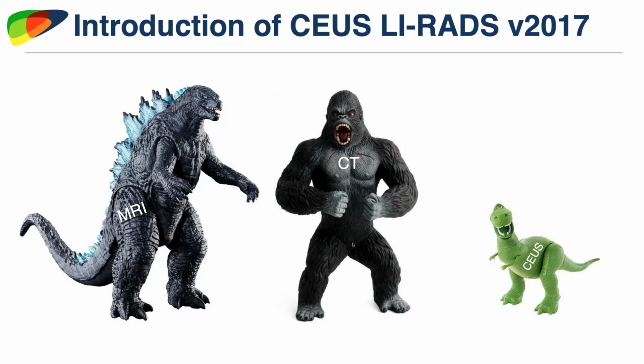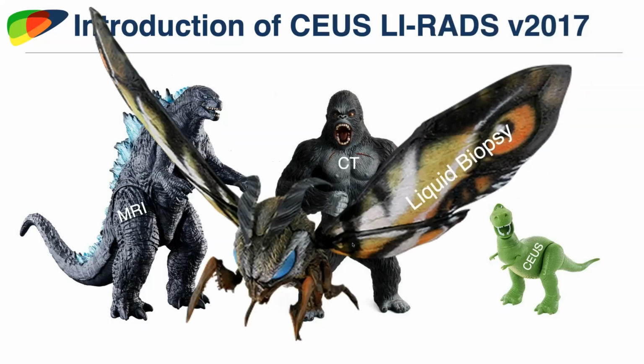Well, keep in mind that every modality has its drawbacks and its benefits. And I don't think any one tool has all the answers. And I think anyone who is knowledgeable and comfortable with a wide variety of tools can offer an individual patient the right test for the right time, for the right situation. And keep in mind that technologies are always changing. So even though we have these modalities at our disposal now, who knows what's coming down the pipe and will be replacing imaging as a diagnostic tool for HCC. So we all need to keep our minds open and go where the data takes us.